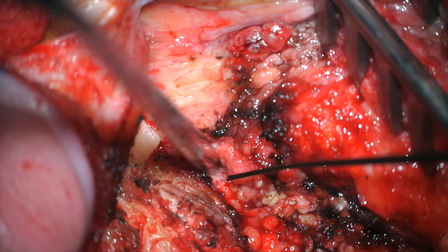Stop, because 0.9 is a little high. So now let's put this down to 0.5. Okay? Try again in the same spot at 0.5. Okay, so that's pretty good. Now let's go down to 0.3, because for a raw nerve in the parotid, you should get a response at 0.3. So now go again. There you go. Okay? So now you know you're there.